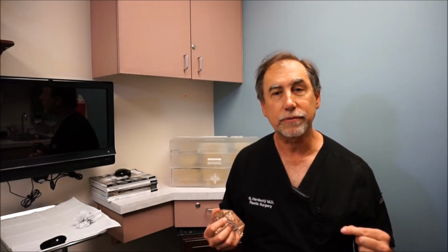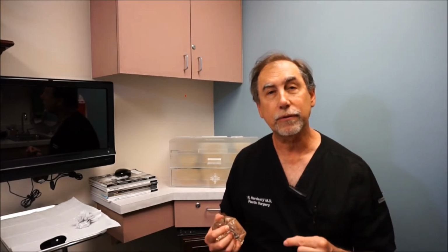So how do we prevent it? We use gentle, meticulous technique at the time of surgery, absolute hemostasis. We place it subpectorally and through an inframammary incision. We wash out the pocket with antibiotics. We use a no-touch technique. We put on a film barrier, change our gloves, and we give you oral antibiotics after surgery and IV antibiotics before surgery.